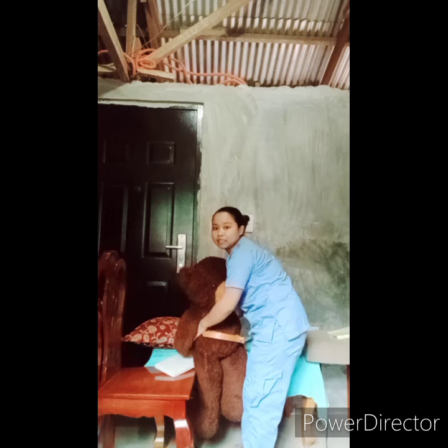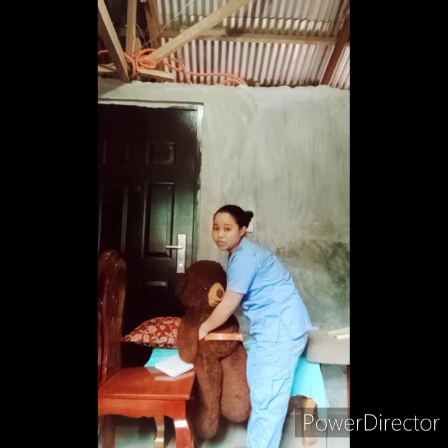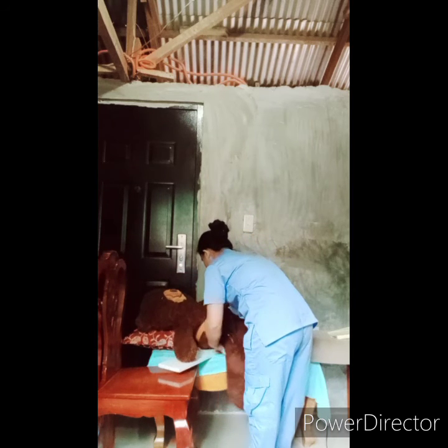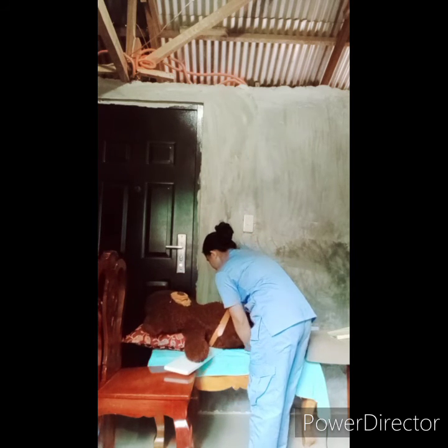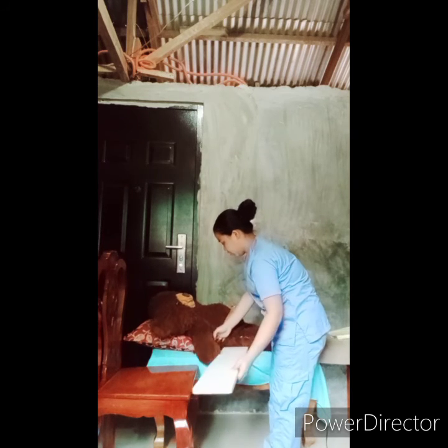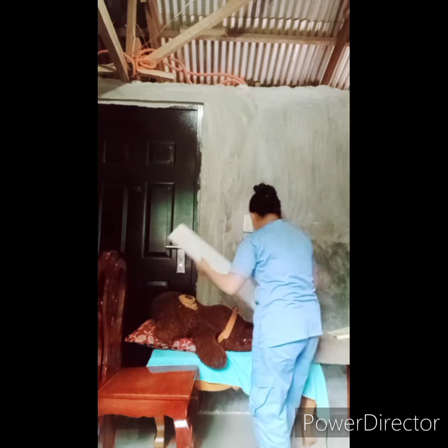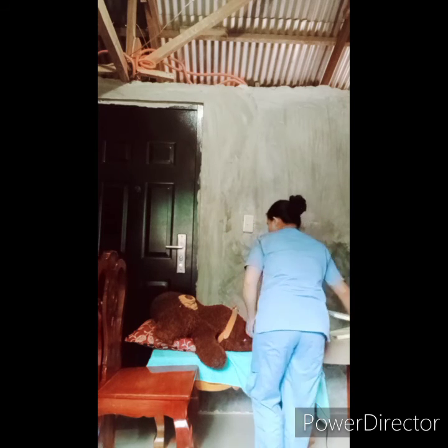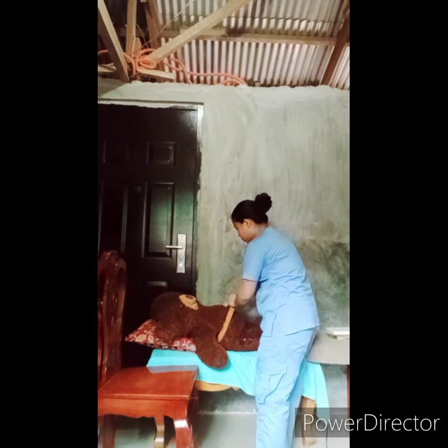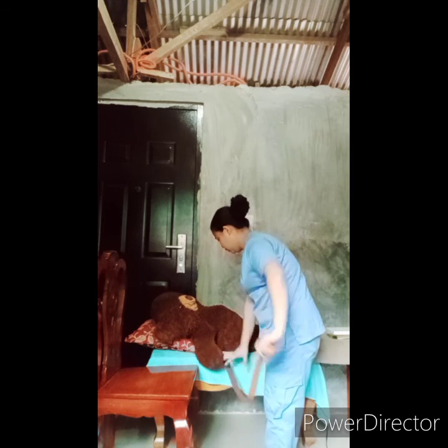And then next, let's follow the steps in 4J1 when helping the patient to a comfortable position. And then let's put the patient in a comfortable position. And then let's remove the transfer board properly. And then also let's remove the transfer belt to make the patient comfortable.